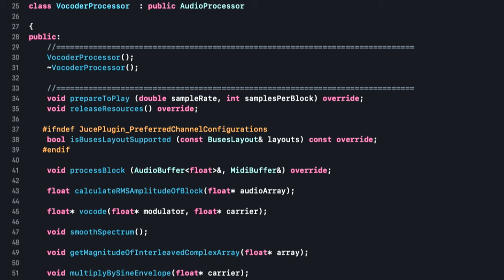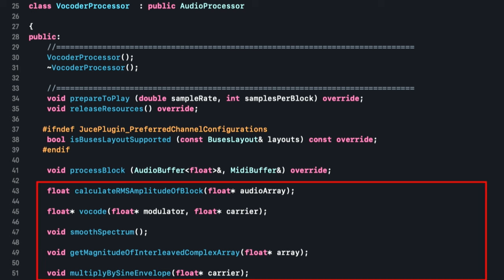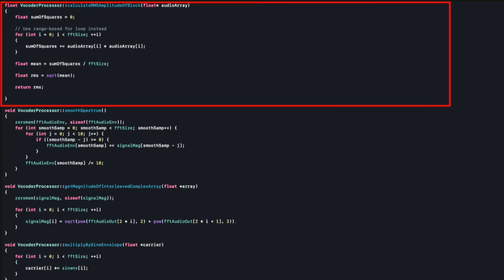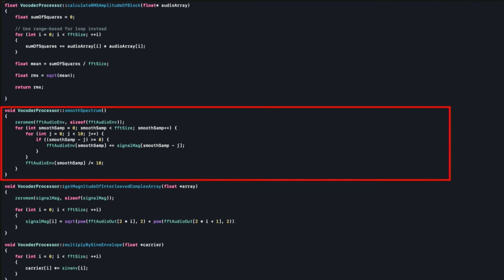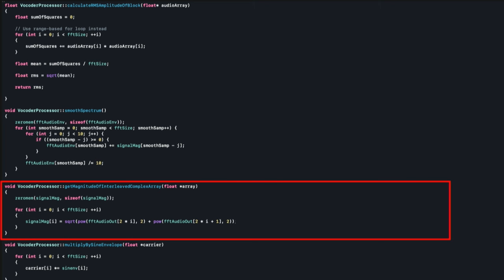Let's jump into some code. Looking at the plugin processor for the vocoder, we'll focus on a few key methods. The calculateRMSAmplitudeOfBlock function calculates the mean RMS amplitude of a block of audio samples of size FFT size. The smoothSpectrum function takes the average of the signal magnitude as a kind of low-pass filtering operation to help extract the envelope of the signal. The getMagnitudeOfInterleavedComplexArray function calculates the magnitude of a complex array such as FFT data, and the final function multiplies the carrier signal by a sinusoidal envelope.